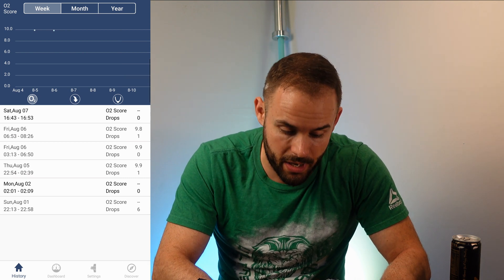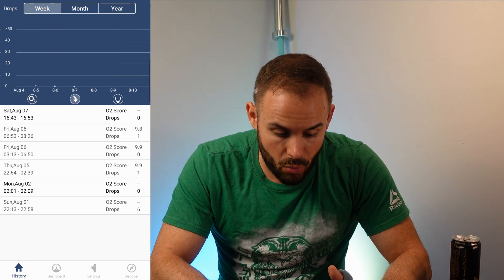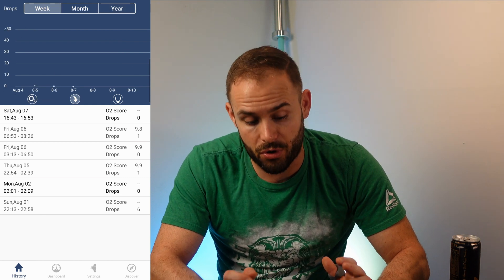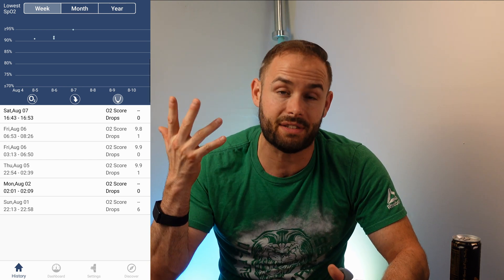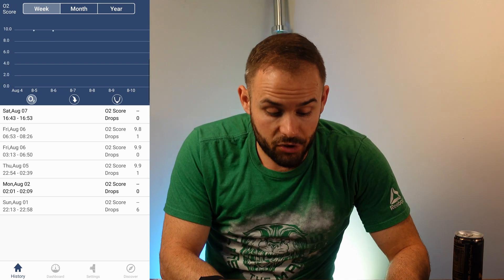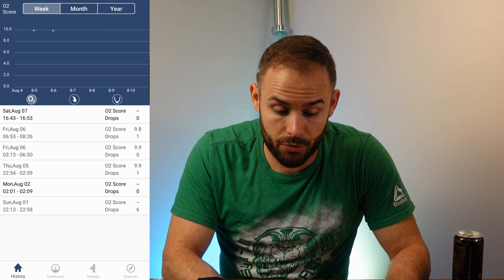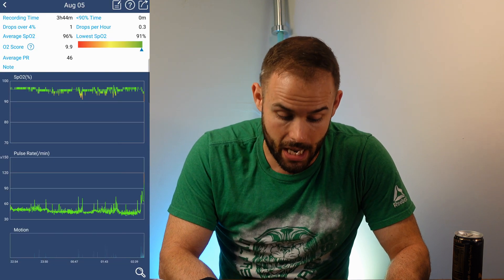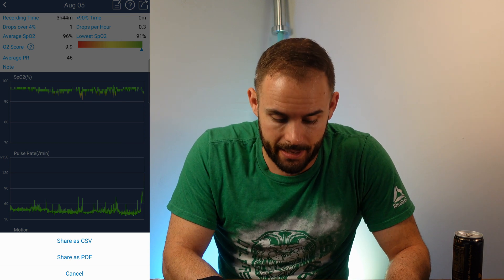The app gives you a score at the top for the week, month, and year. You can view your O2 levels, your drops, and your lowest SpO2 scores to track progress over time. Another great feature is that you can download this data and send it to a doctor as a CSV or PDF file, so if your doctor needs extra information, it's right there in the app.